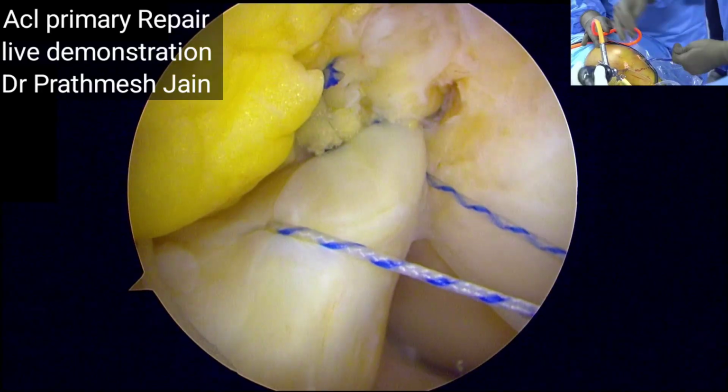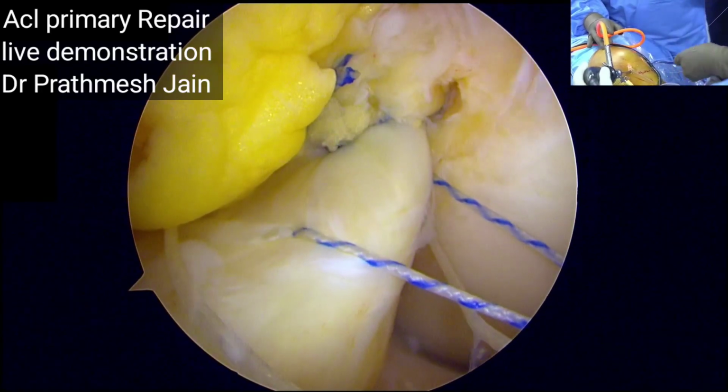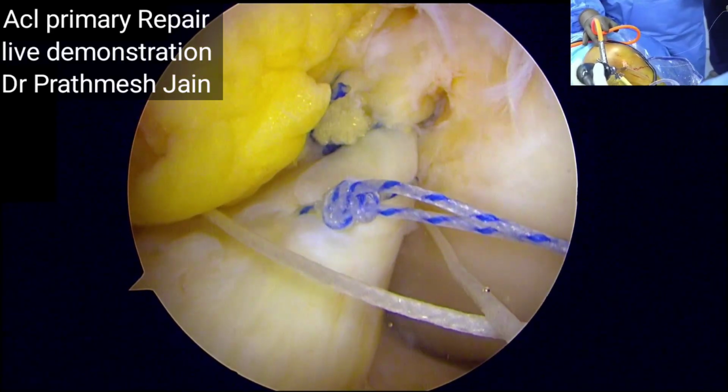It's a physeal sparing surgery. So if you are doing it in a young patient, it is a physeal sparing technique. You don't drill anything into the physis. You are very safe as far as the repairs are concerned.